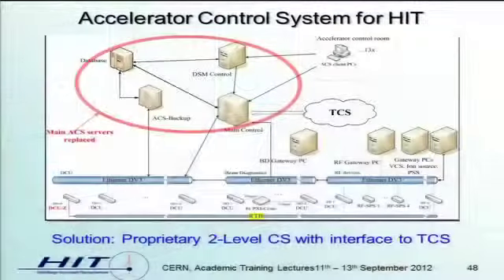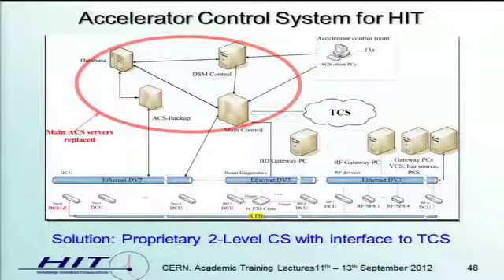Okay, how can a control system for a facility like HIT look like? We have decided to have only a two-level control system. So we have the real-time level here. There we have different devices for the power supplies, RF, and these devices.